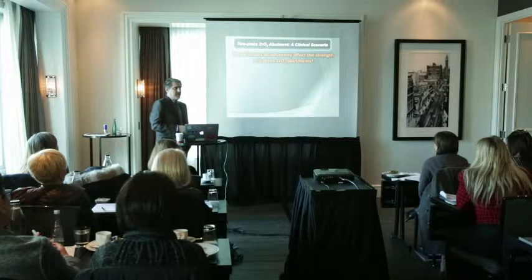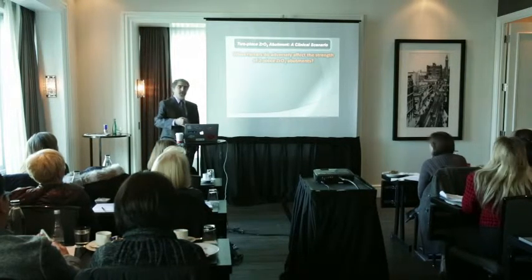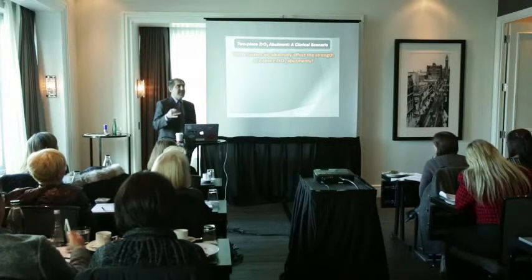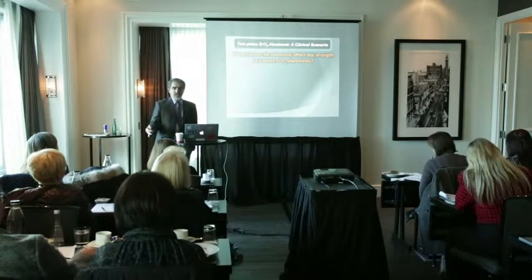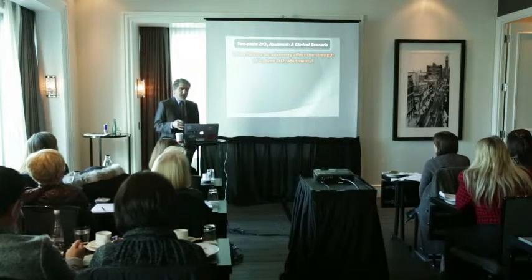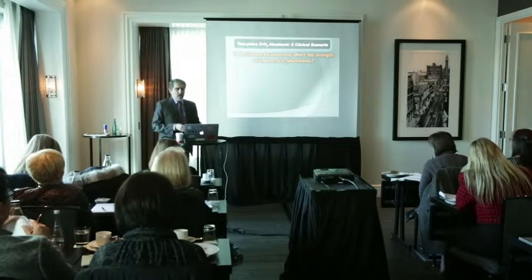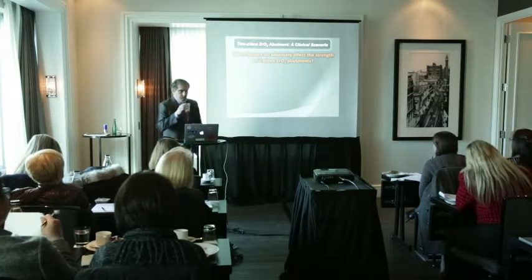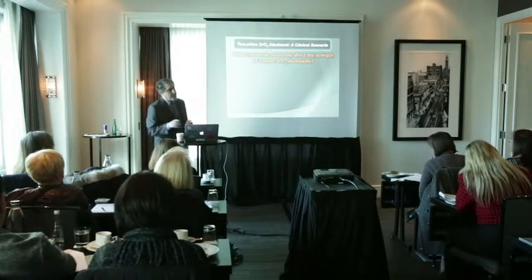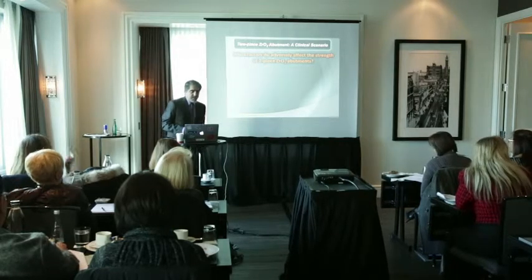Now we know that the two-piece zirconia abutment is going to give us fewer complications and fractures. We're going to have fewer problems. So let's see what the best options are with the two-piece zirconia abutments, and how we can prevent problems with the two-piece, the better zirconia abutments.